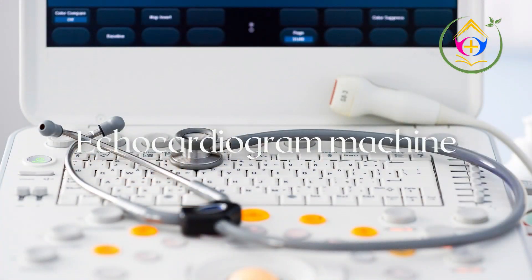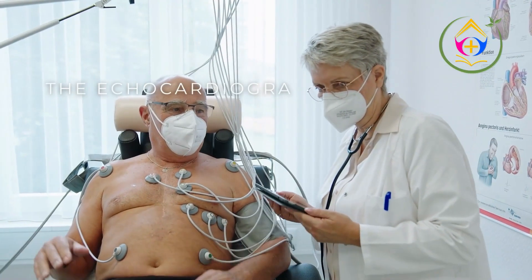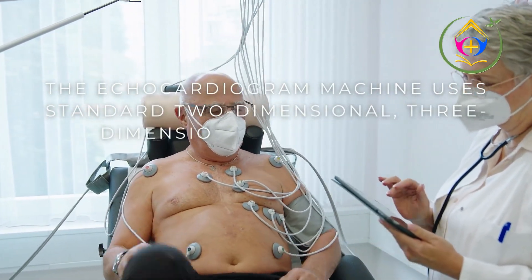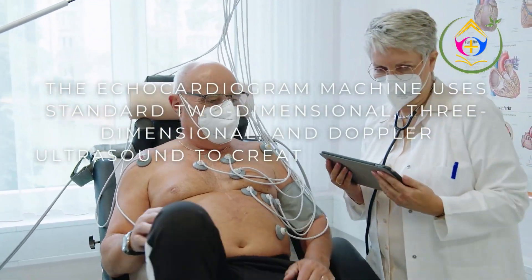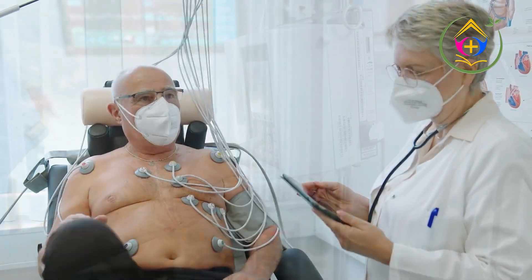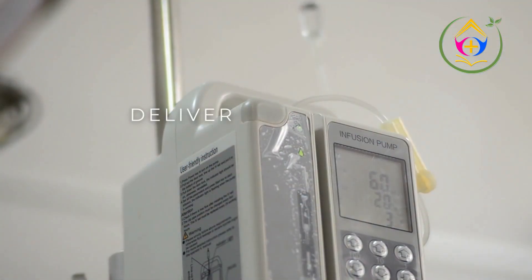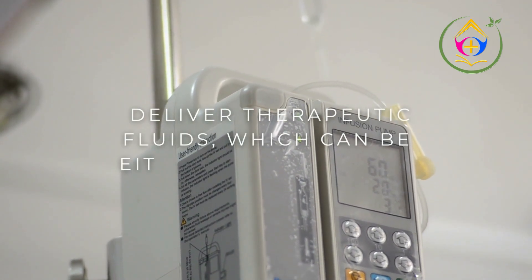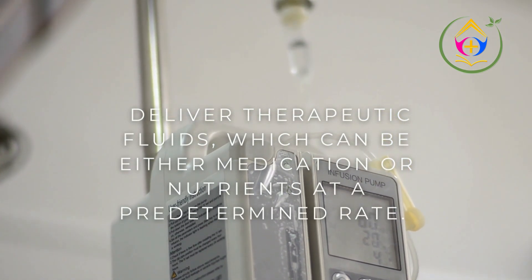Echocardiogram Machine: uses standard two-dimensional, three-dimensional, and Doppler ultrasound to create images of the heart. Infusion Pumps: deliver therapeutic fluids, which can be either medication or nutrients, at a predetermined rate.